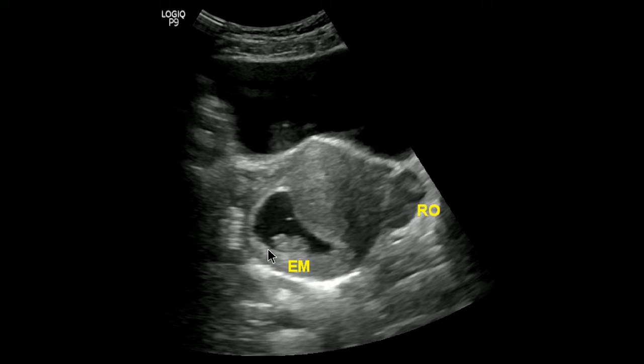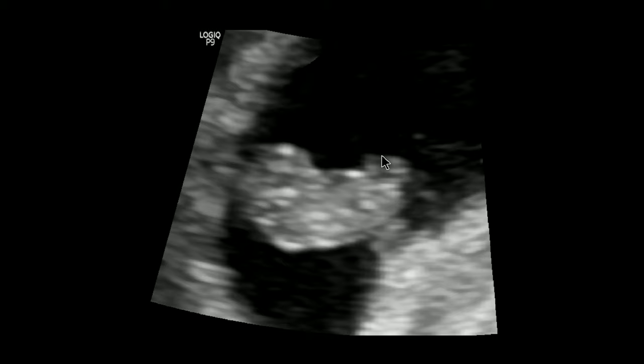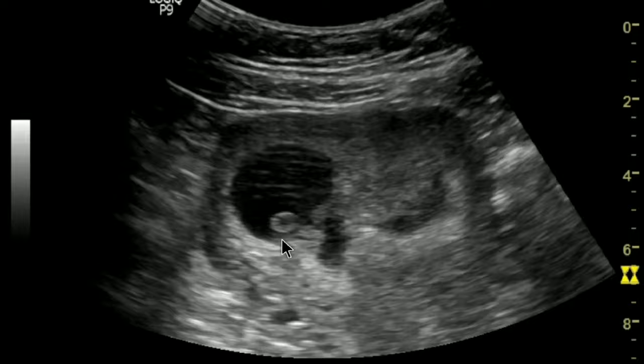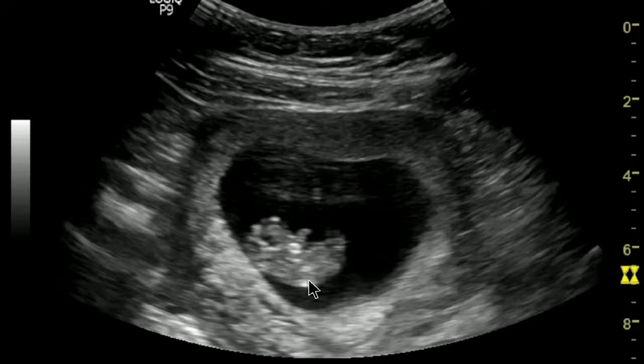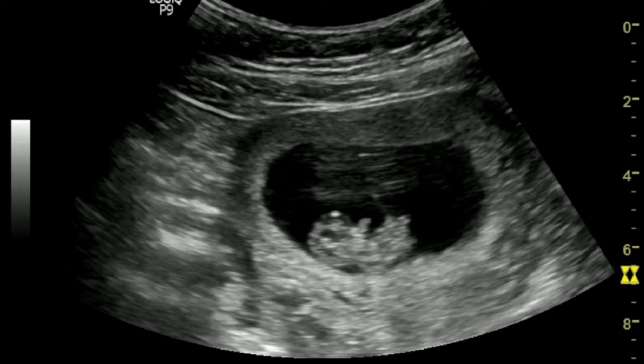At the seventh week, you can see the embryo. At this age, we can't actually see the embryo's parts well. The thicker part is called the cranial region and the thinner part is the caudal, meaning the thoracoabdominal region. One to two weeks later, you can easily differentiate between head and body. At the eighth week, fetal cardiac motion is well seen. At around the ninth and tenth week, fetal tone and movement centers develop respectively. Tiny embryo starts to jump, creating a smiley face on the mother watching that. Cardiac activity can be better visualized using color Doppler at this age. Some doctors don't want to use color Doppler to detect heartbeat at this early age due to those hypotheses mentioned earlier.